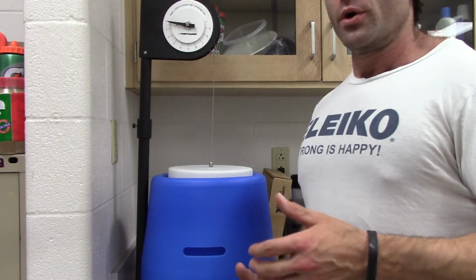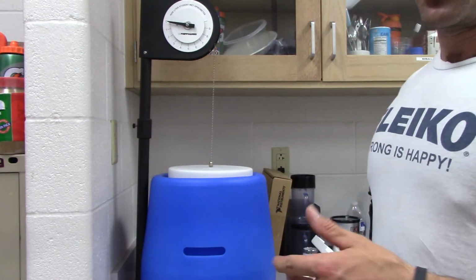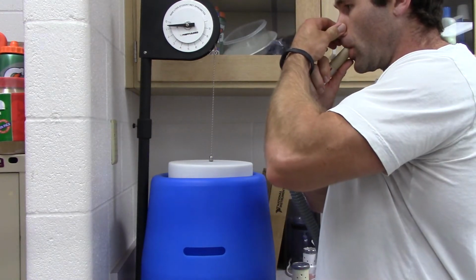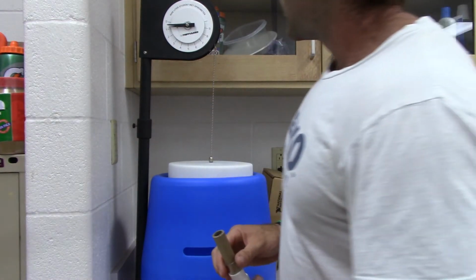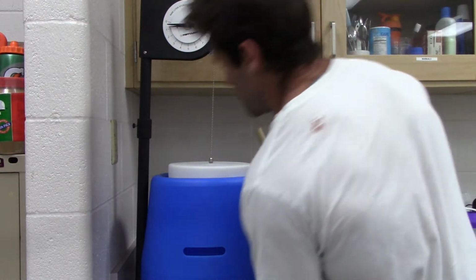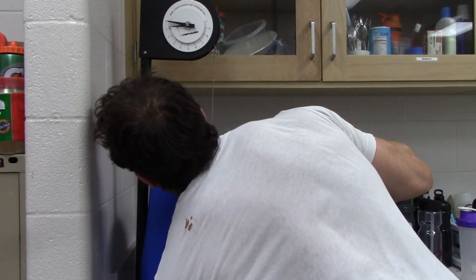Now, what we're going to do with this lab is just do a couple of tidal breaths. Typically you're going to do 3, so just a normal breath in and then a normal breath out. And we're seeing that my tidal volume looks like it's about 0.75 liters. Now you're going to do 3 and take the average of it. Obviously, if you're just watching from home, you're going to take this.